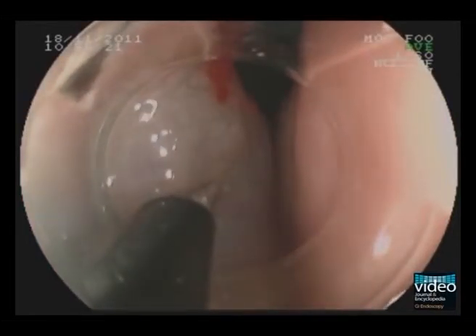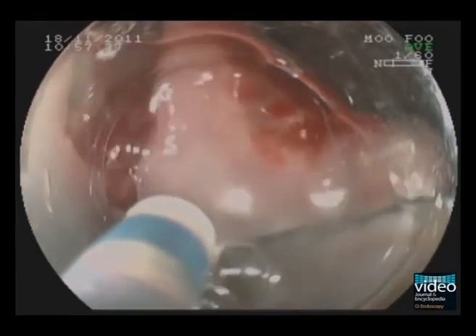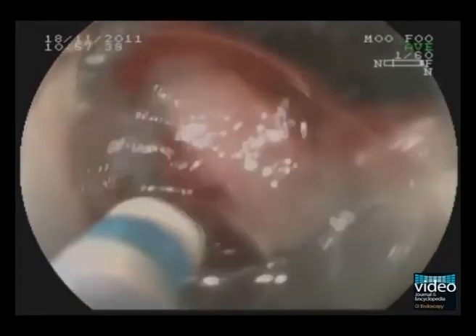After having cut the proximal margin in retroflexion, cutting should continue to appear in the frontal view of the endoscope. Cutting the mucosa on the folds can be more challenging due to an increased risk of perforation.